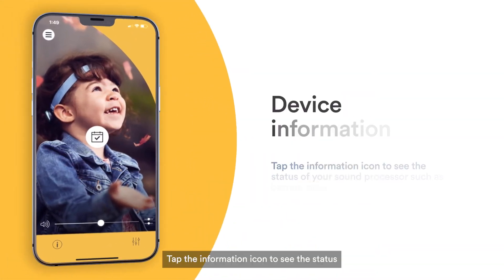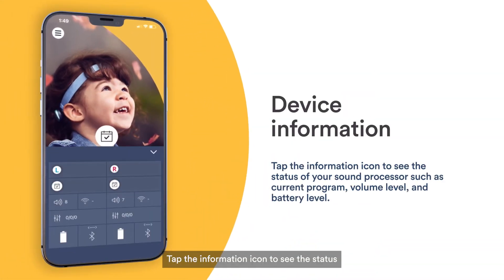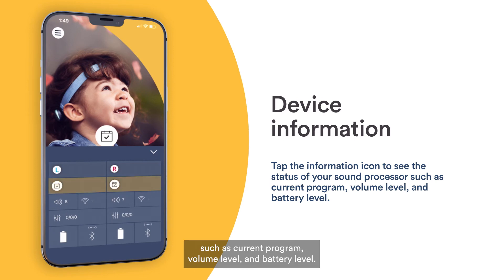Tap the information icon to see the status of your sound processor, such as current program, volume level, and battery level.